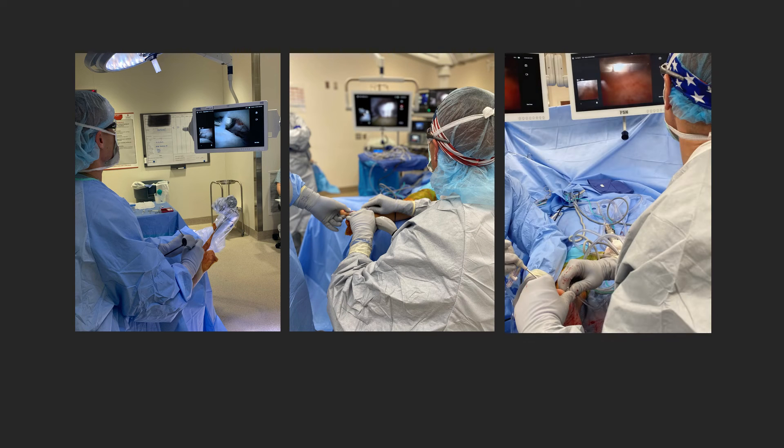You can see a couple of different positions — it allows me to look and be comfortable whether standing or sitting. As I get in and start shaving, this patient has very little cartilage remaining but a lot of thickened tissue that needs to be removed. This is really allowing me to examine the joint and taper my dorsal cheilectomy. As you can see, she has lost a large central part of the dorsal head, and this is her pain generator.